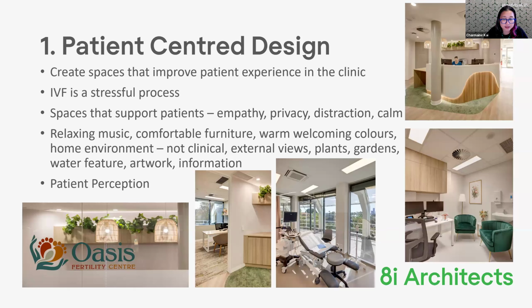As an example, the ET room that I've got through here has nice views outside. For privacy, we've got external blinds that drop down so no one can see in, and then the patient can get changed and have their embryo transfer. So things like comfortable furniture, relaxing music, some warm colors, creating more of a home environment so it's not so clinical.